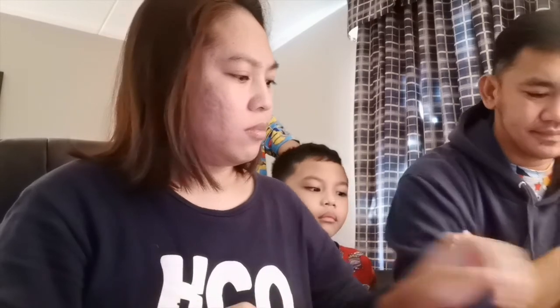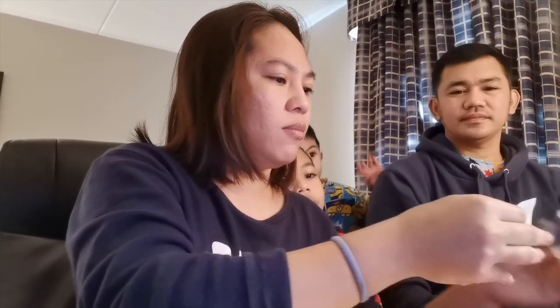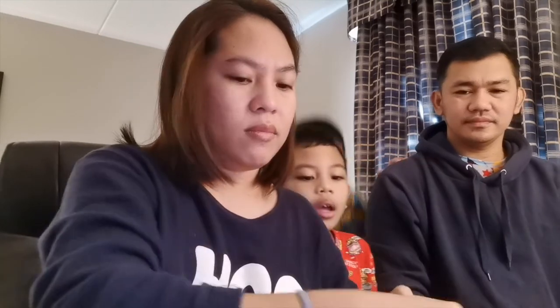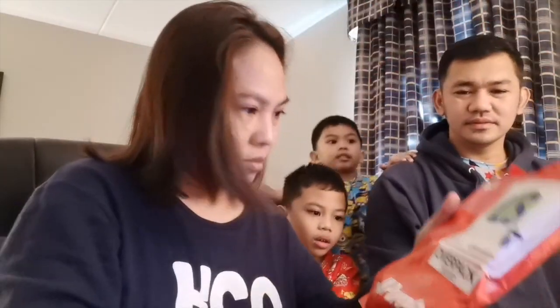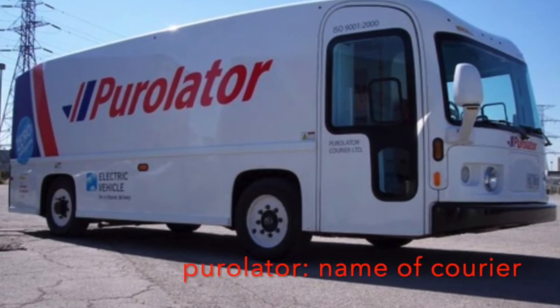Yeah, perfect. And now with the alcohol swab that they give you, you gotta wipe around it. Just make sure you don't wipe the label. Oh, wow. Okay. Okay, awesome. And that's it. Once you're done, schedule the time for the Purolator pickup.